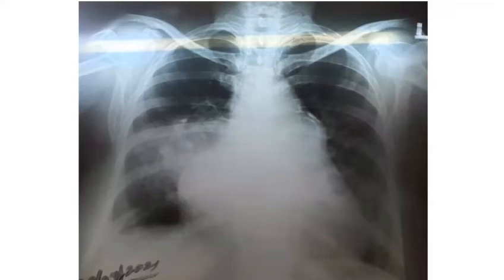There is a cardiomegaly seen. There is a calcification seen on the left border. That is possibly the pulmonary artery. Maybe so. And sir, RA is enlarged. No. If you look here, you can see two lines seen, two parallel lines of calcification. PDA. Yes, very good. Excellent. It is a ductus calcification.